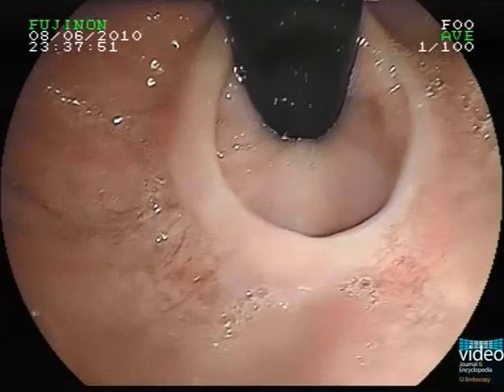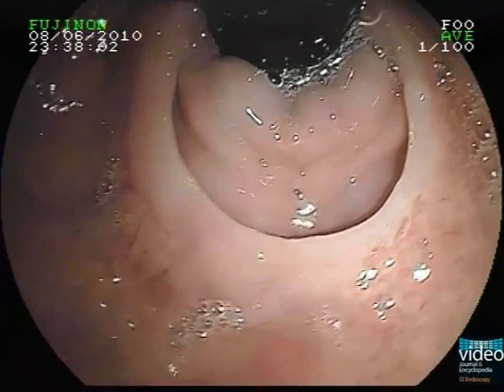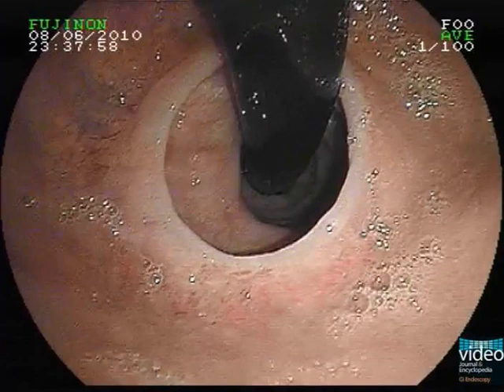The Schatzky ring can be better visualized in the inverted position. Therefore, it is advisable to always inspect the esophagogastric junction in the retroflex position. This patient was later treated with bouginage up to a diameter of 16 mm, and symptoms disappeared afterward.